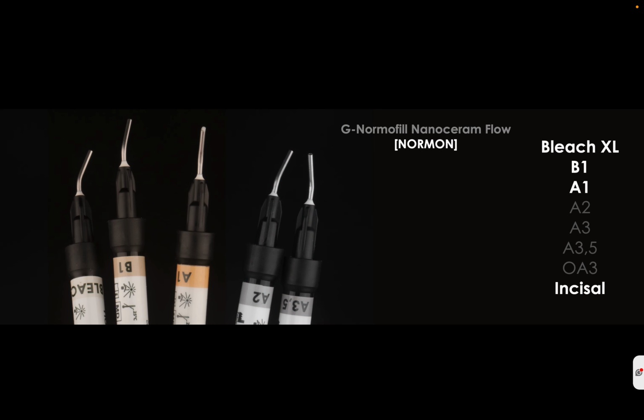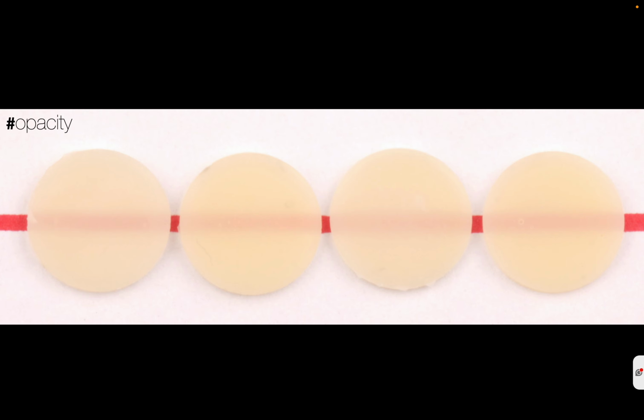But this is something that the patient has to choose. And then an important thing is the opacity. The opacity has to be good enough to mask as much as you can, but it depends for sure on the thickness of this material.